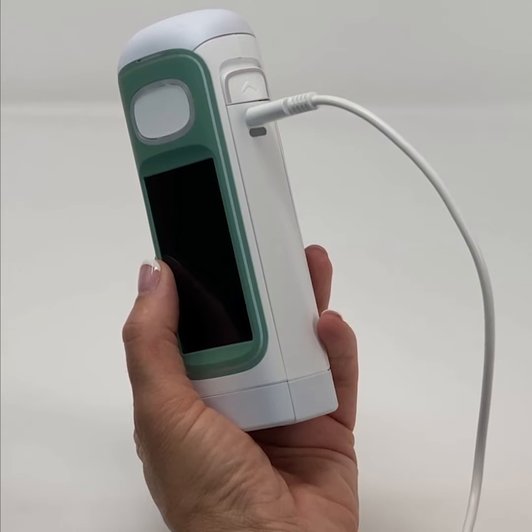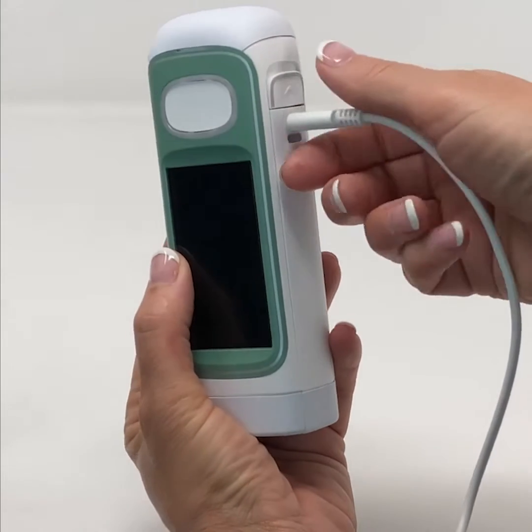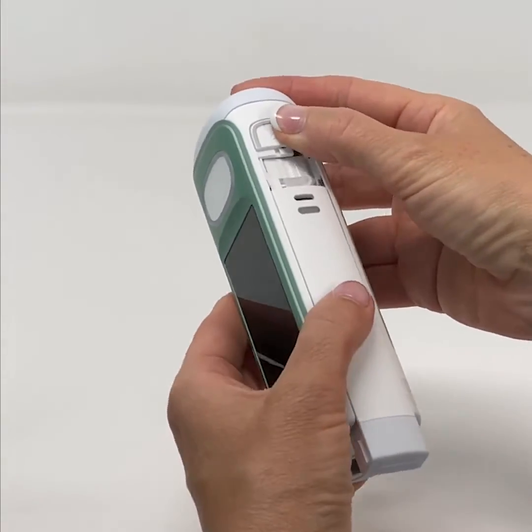You can charge the battery while it's in the device, or you can remove the battery and charge it outside of the device.